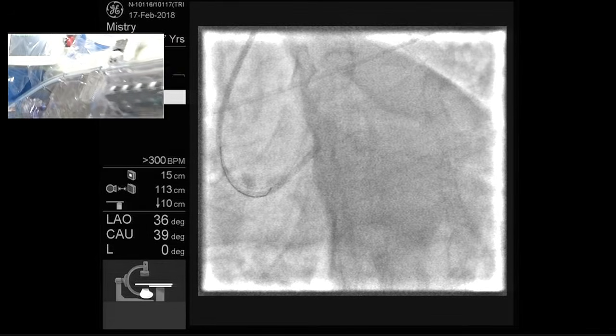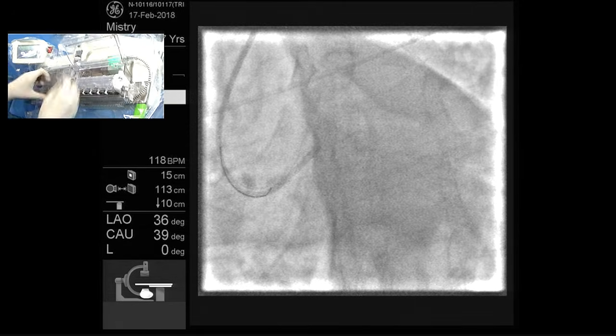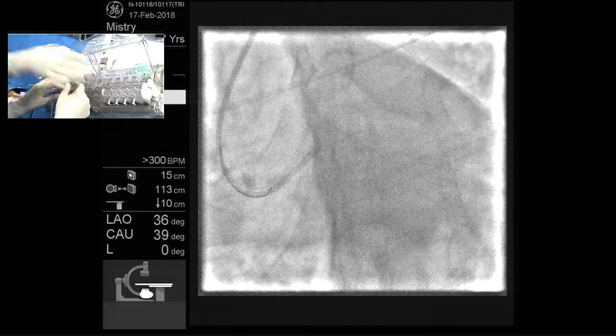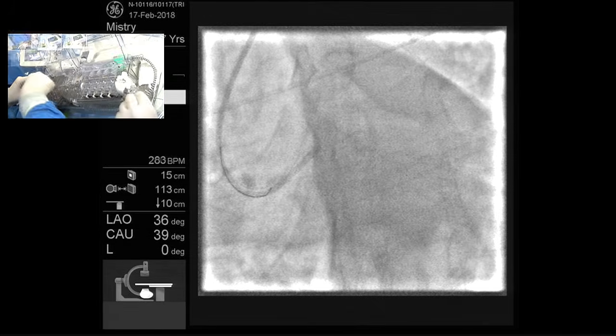Out of many different things that are changing here, Dr. Patel, we rely so much on tactile feedback. How did you overcome that lack of tactile feedback working with this? I take help of the balloon, wherever I am really interested in my tactile feeling.